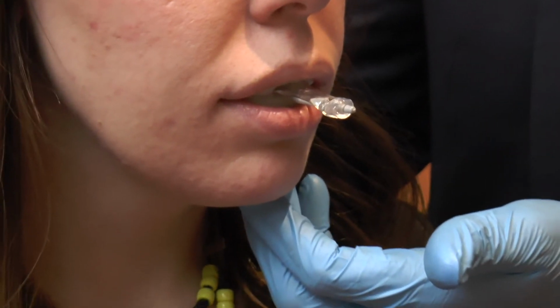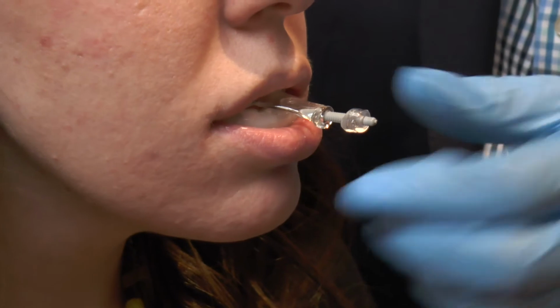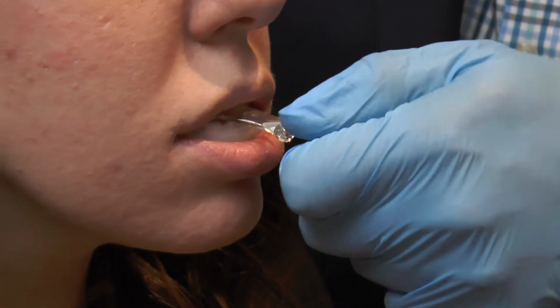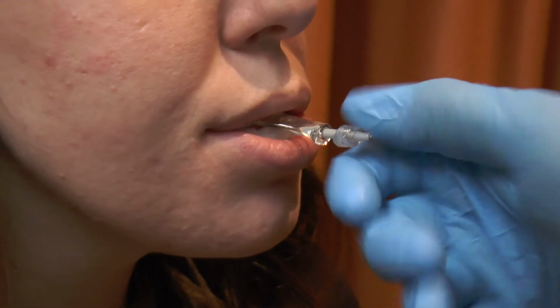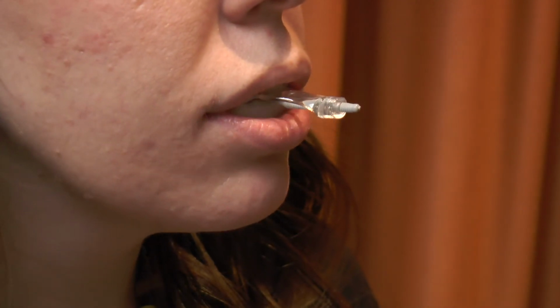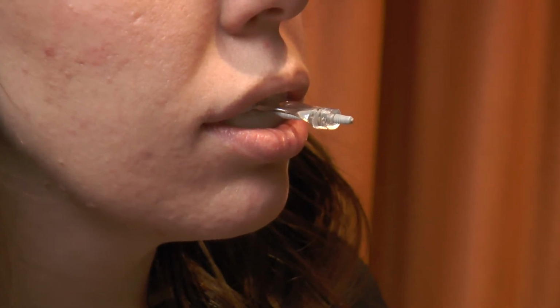What I would do is go ahead and slide all the way forward. I would basically dial the screw to about midway off her range. So this is roughly about 50% or so of her protrusion. To dial the screw in, it's a clockwise turn. And go ahead and let it slide back again. And this is approximately taking a lower jaw about 50% of her entire range.